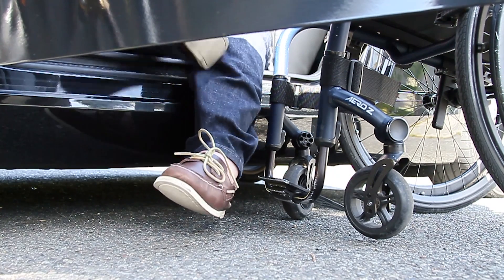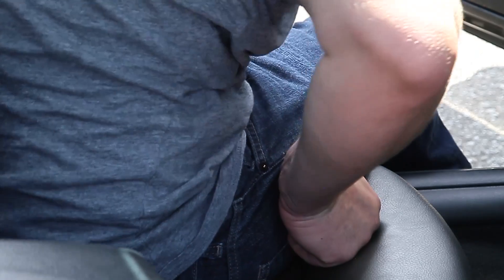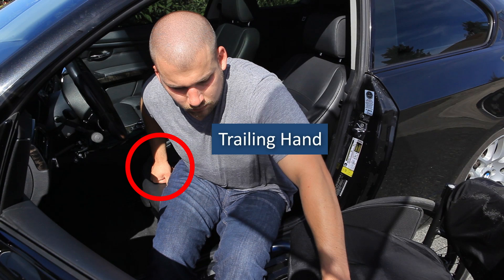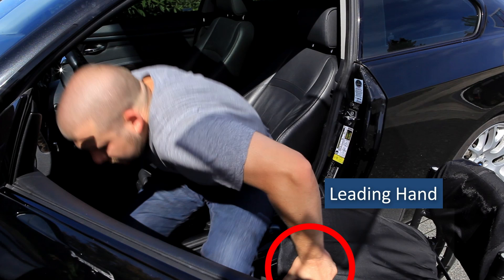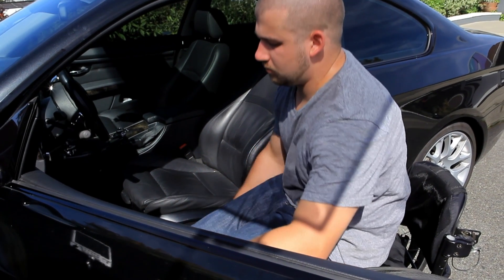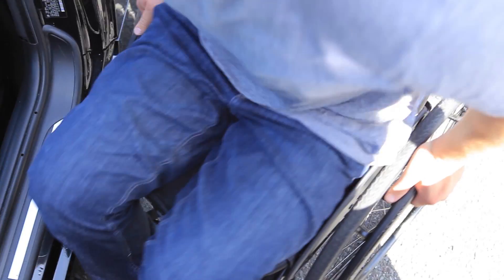To get out of your car, bring your feet out to the ground and shift to the corner of the car seat. Place your trailing hand by your hips and the leading hand on your wheelchair cushion or the front section of the frame. Lift and swing your hips over to your wheelchair. Place your feet on the footplate and reposition your hips.